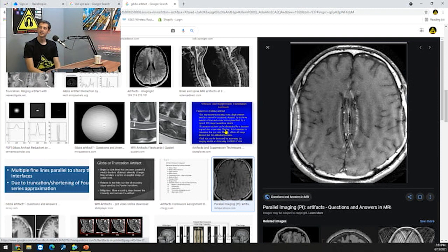That's the wrap. That's what happens if you do GRAPPA, but not the math that happens afterwards. And part of the math, again, is those coils; the system knows where they physically were. So it overlapped so much that it didn't finish unwrapping it, or the wrapping is still in the image?